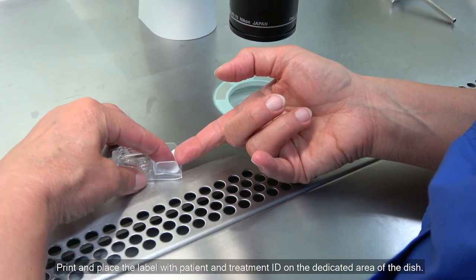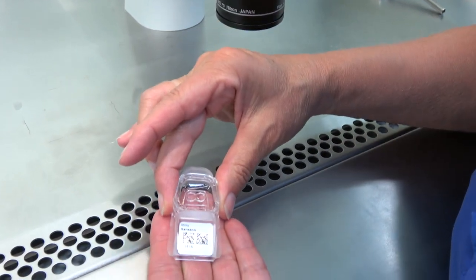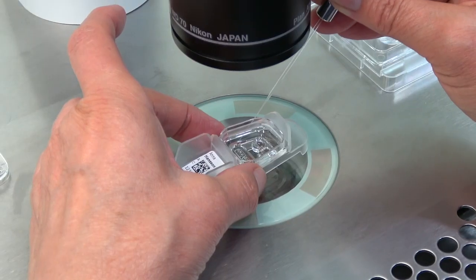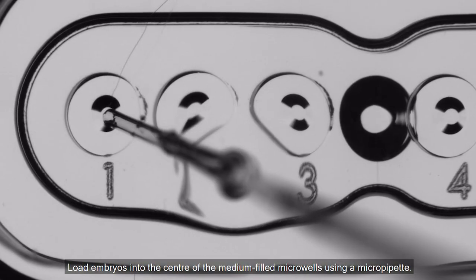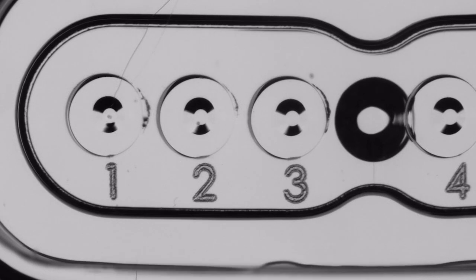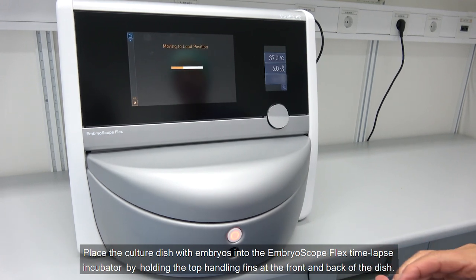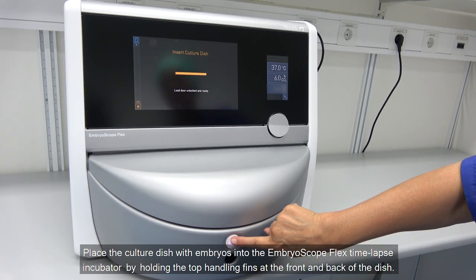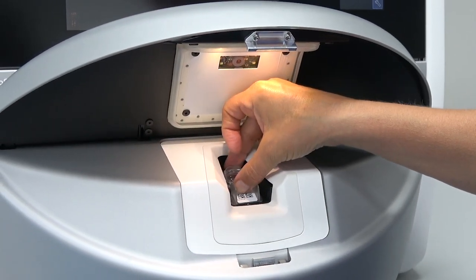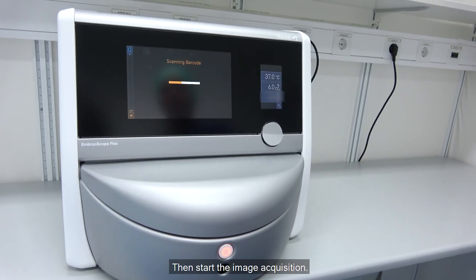Print and place the label with patient and treatment ID on the dedicated area of the dish. Make sure the label is applied smoothly. Load the embryos into the centre of the media-filled micro wells using a micro pipette. Place the culture dish with embryos into the EmbrooScope Flex time-lapse incubator by holding the top handling fins at the front and back of the dish. Then start the image acquisition.